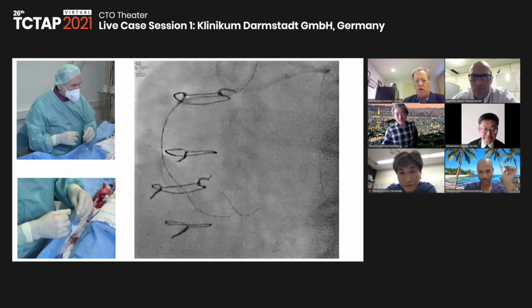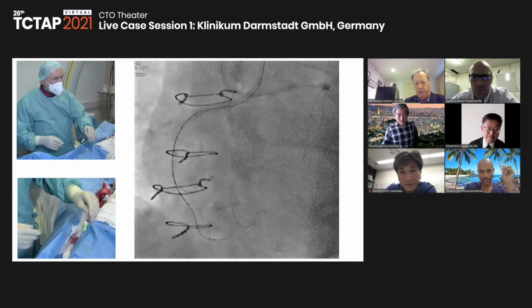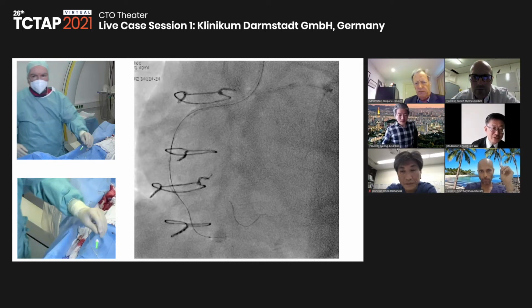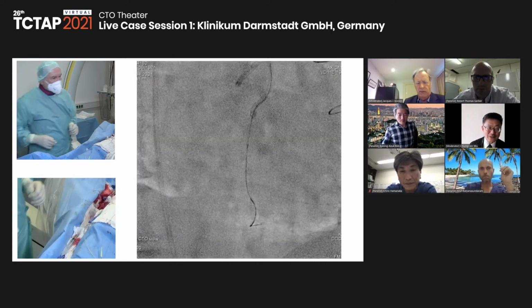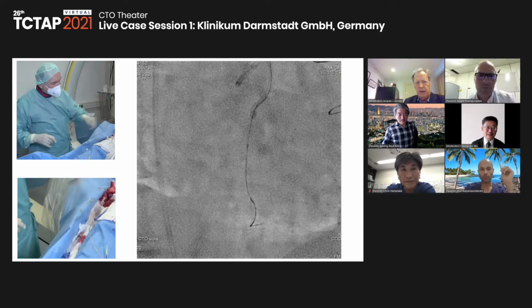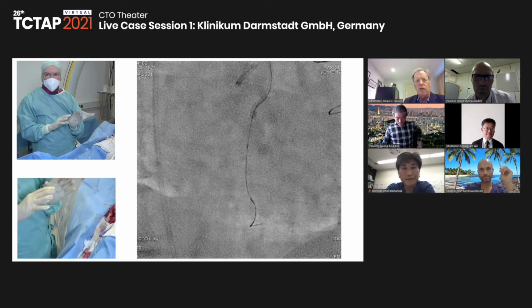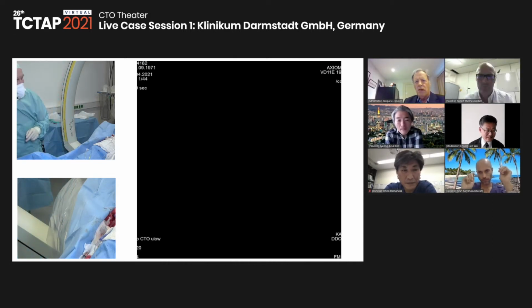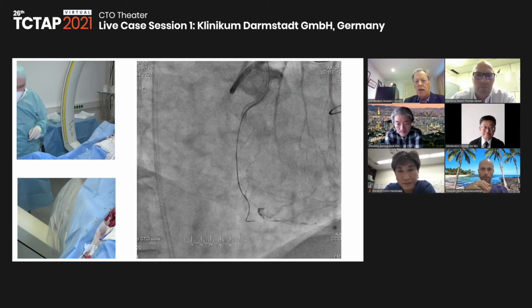Yeah, there's a lot of movement. Okay. The tip is moving too much, because from the original CT, it seems they have a full movement calcium. Yeah. So we probably go around this calcium. So I will stay there, and now we will try the contralateral access. Yes. Yeah.